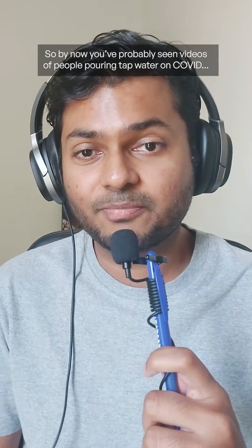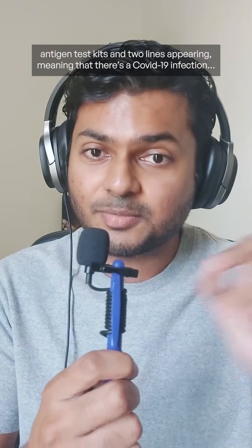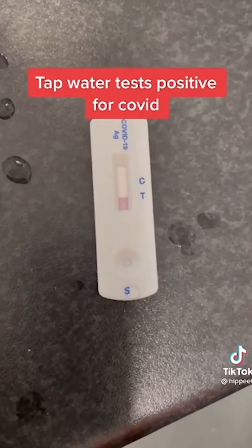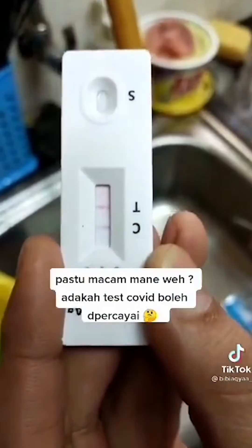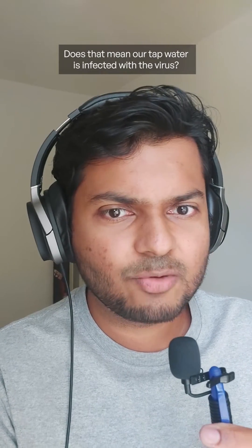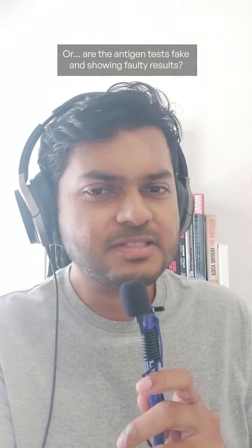By now you've probably seen videos of people pouring tap water on COVID antigen test kits and two lines appearing, meaning that there's a COVID-19 infection. Does that mean our tap water is infected with the virus? Or are the antigen tests fake and showing faulty results?